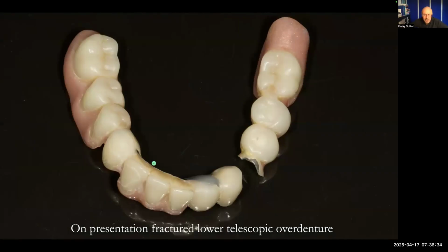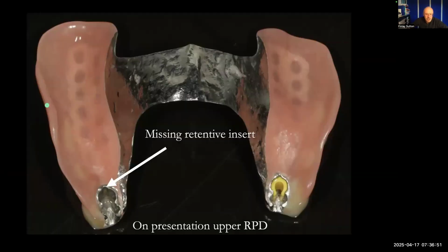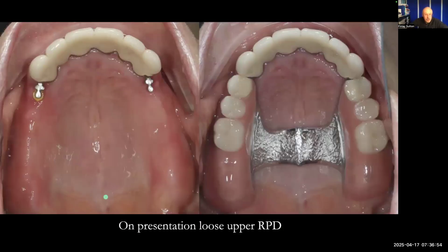Let's have a look at the upper. When I looked in her mouth in particular, I could see that we've got these linked crowns, and then we've also got an attachment on there that used to fit inside the denture just here, but it had come off and it was actually wedged into the gingiva just there.